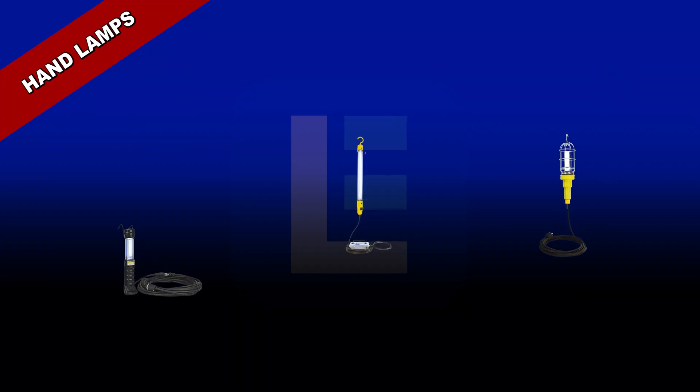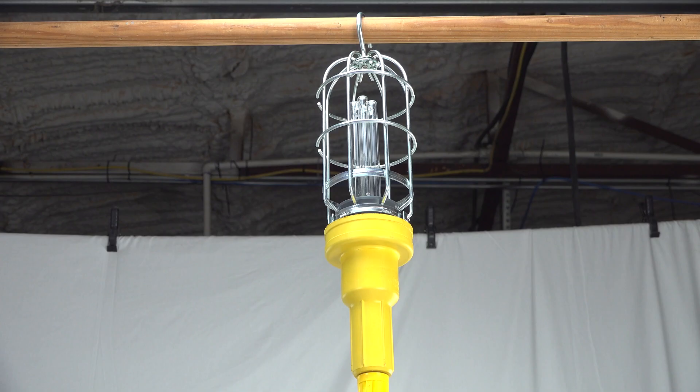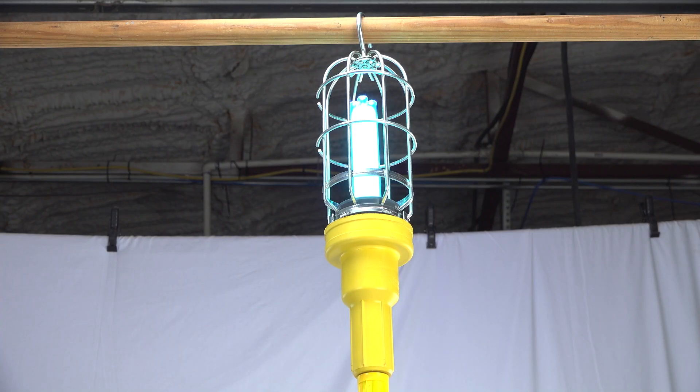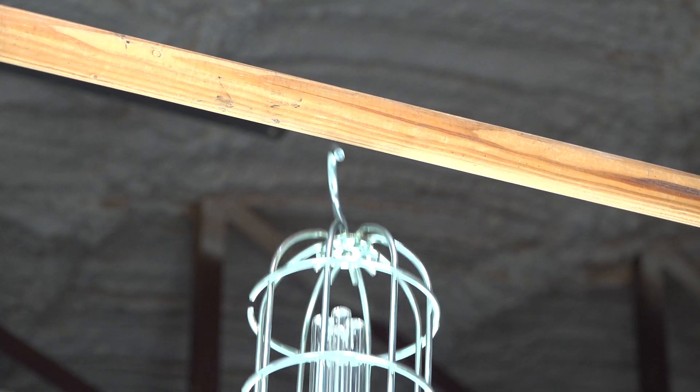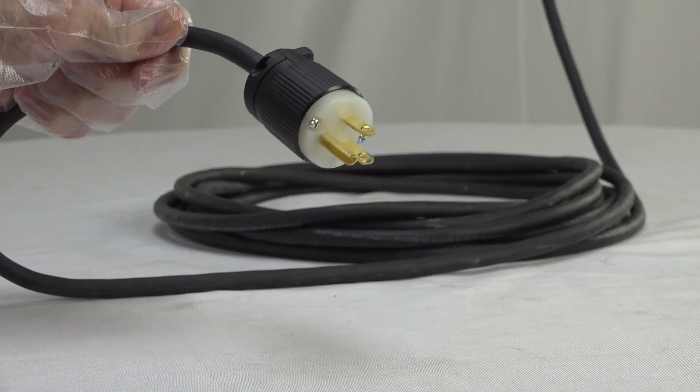UV hand lamps. Our hand-held lamps offer 360 degrees of UV coverage for close-up sanitation. The lights have a hook for hands-free operation and a chemical and abrasion resistant cord with an industrial grade cord cap.